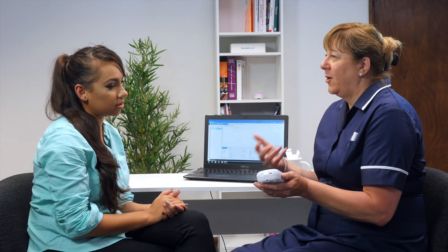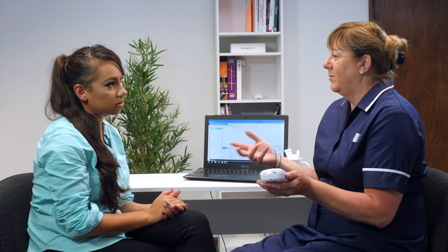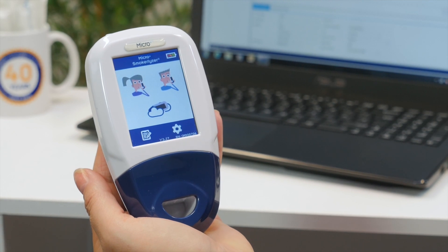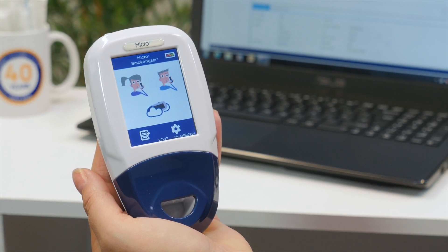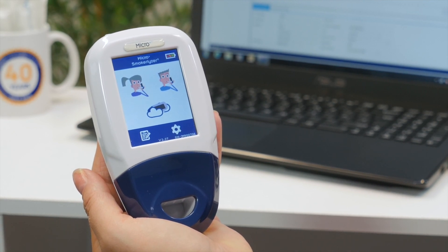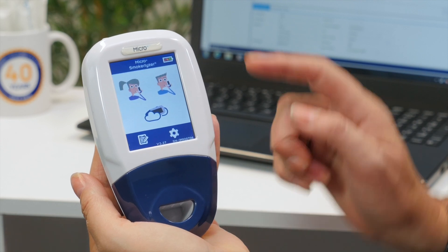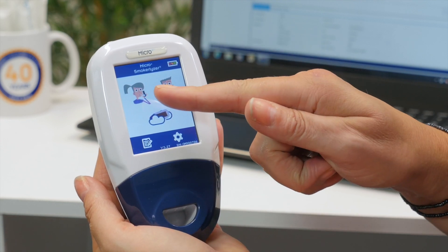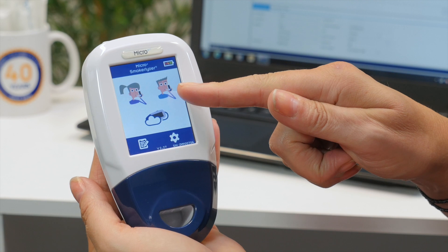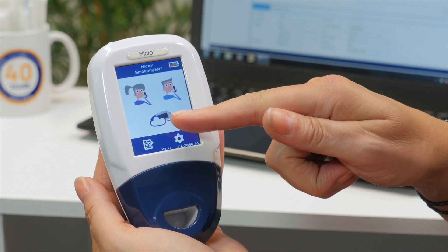The Smokerlyzer also uses a motivational traffic light system to encourage and help track a patient's quit attempt. The Micro+ Smokerlyzer has three options: maternity breath testing, normal breath testing, and ambient CO monitoring.